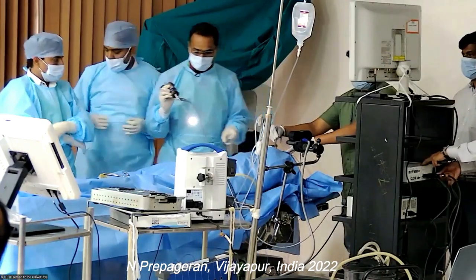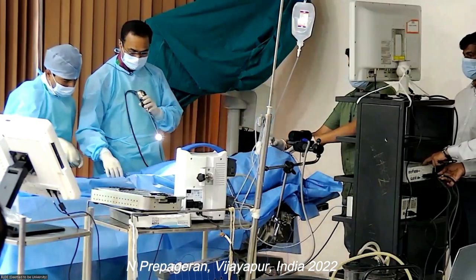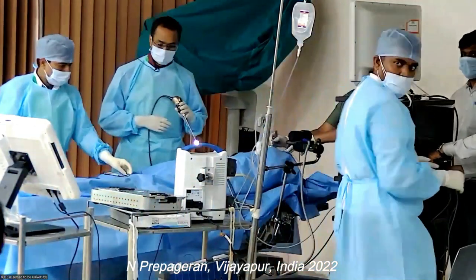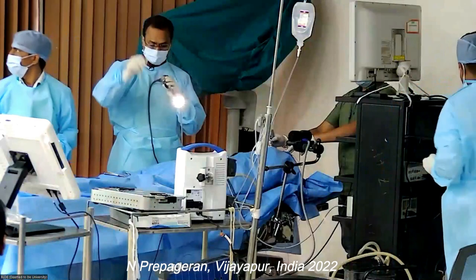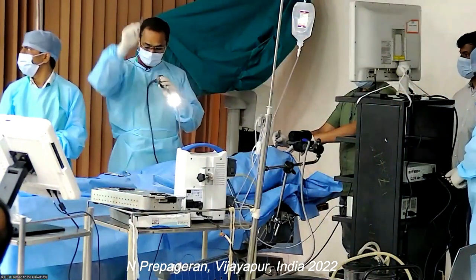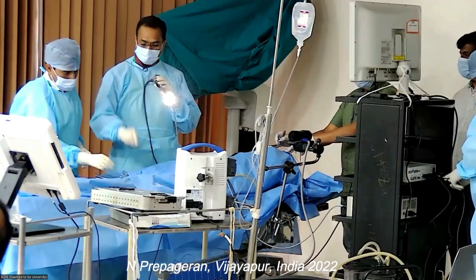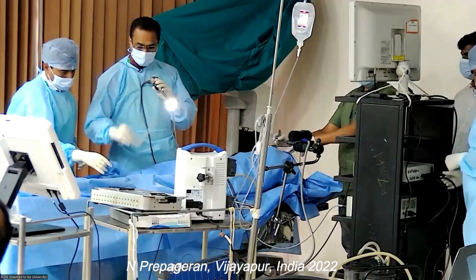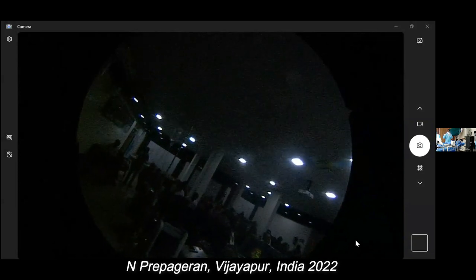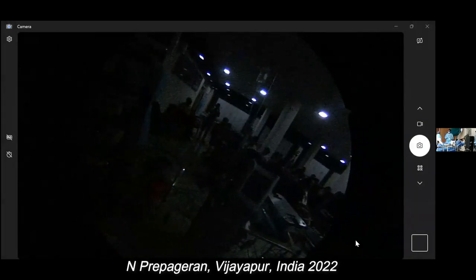So in the meantime, the dissection I'm going to do, I'm going to be using quite basic instruments. A sickle. Oh, no view. Okay. A sickle knife. A Blakeslee. A Freer elevator. A curette for optic nerve decompression. And a Kerrison punch. Oh, we need a scissors as well. So this is what I'm going to use for the dissection afterwards. Okay. So with these 5 instruments or so, you can do the whole.